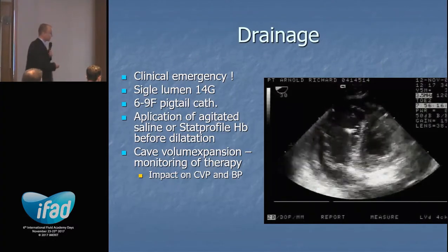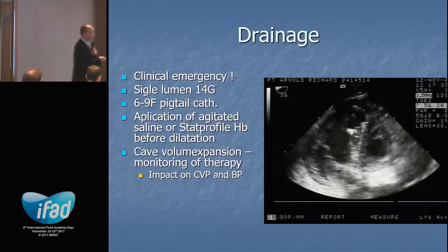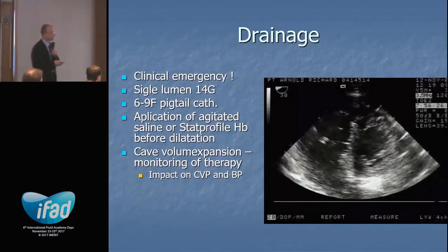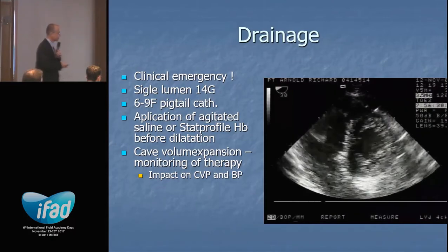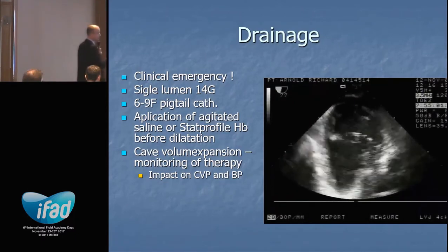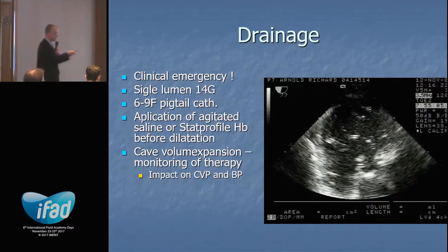So I was keeping the TOE probe in for a long time just to see. Now the moment when I pulled the pigtail out, it disappeared. And just to add and note that even a 4 millimeter hole into the right ventricle can sometimes close itself, and you wouldn't go for the cardiosurgical theater after removing this misplaced catheter.